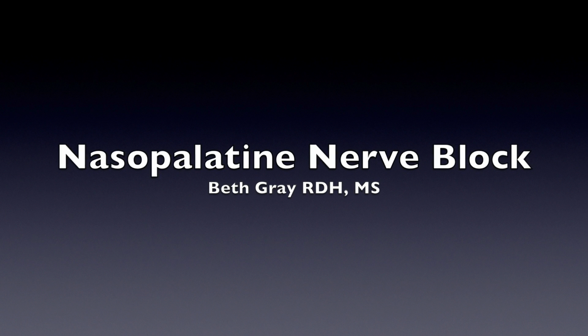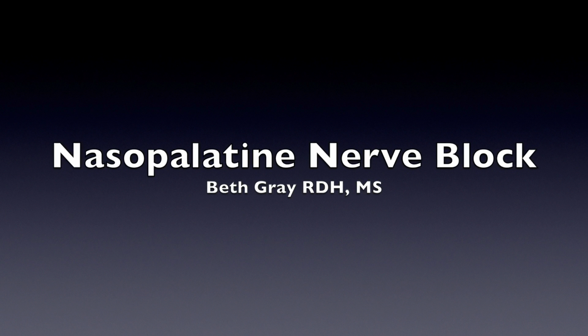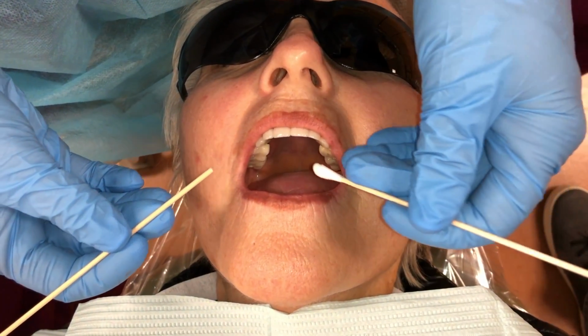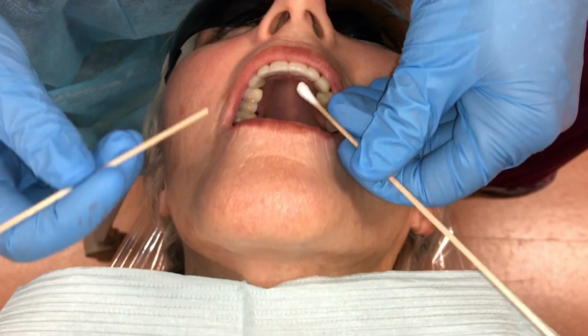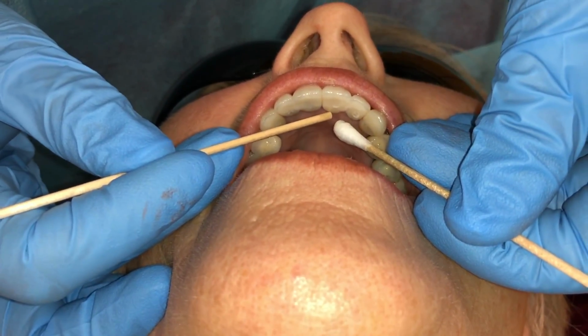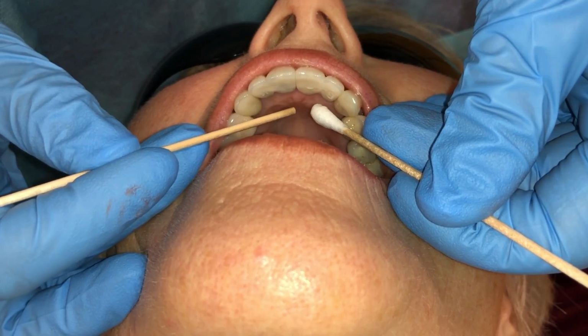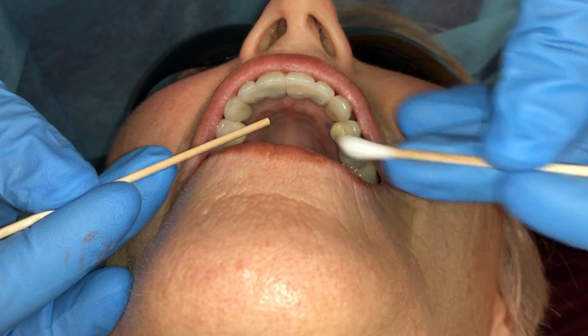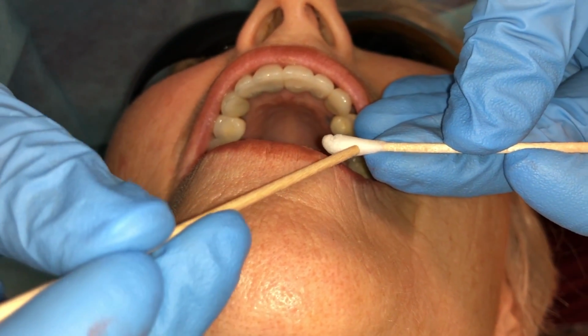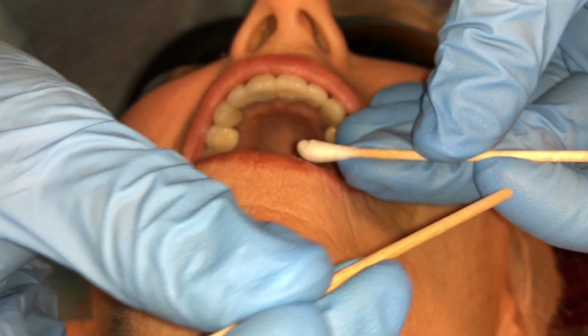The nasopalatine nerve block is indicated for pain management of palatal soft tissue in the anterior one-third of the palate, approximately from canine to canine. A key landmark is the incisive papilla. The clinician should observe the widest portion and identify the lateral side facing the clinician's handedness.